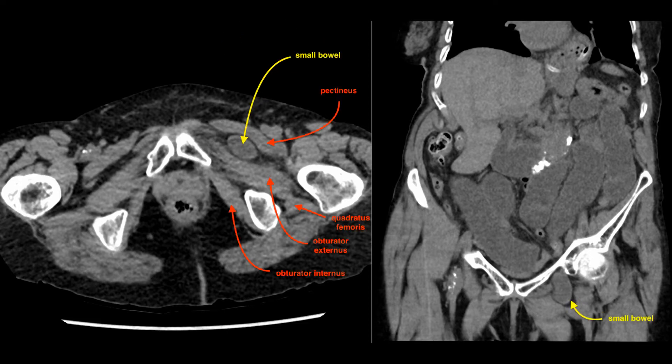A bit of anatomy. Here is the pectineus muscle, obturator externus, obturator internus, and quadratus femoris.